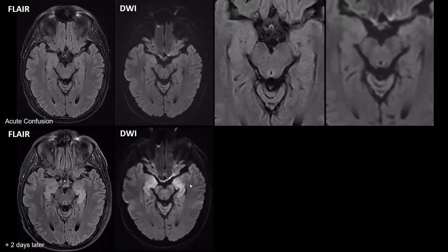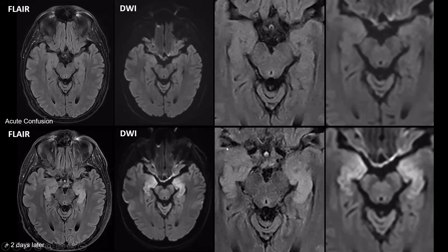We can also check these magnified images. These are FLAIR images and diffusion-weighted images, which were completely normal originally. Then two days later, we have clear swelling and an increase in signal intensity on FLAIR images with diffusion restriction.